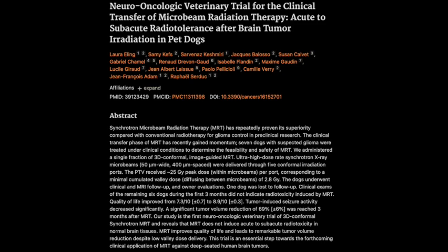I'm picturing like a tiny helmet specially fitted for each dog. Exactly. It's made from a material that softens with heat, so they mold it to the exact shape of the dog's head, and then it hardens as it cools, creating a secure and comfortable fit. So it prevents even the slightest head movement. Yeah. Which is crucial when you're dealing with radiation beams thinner than a human hair.